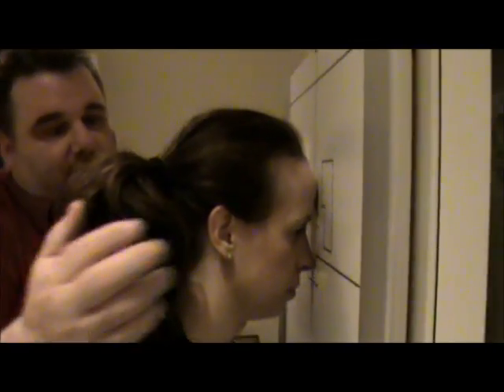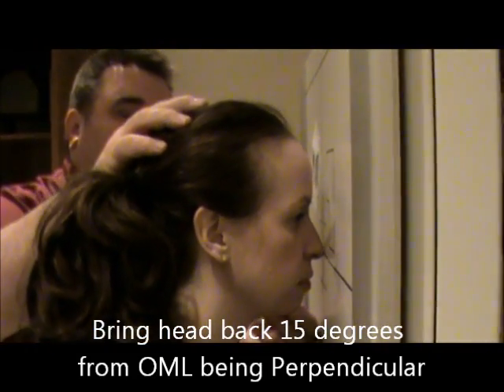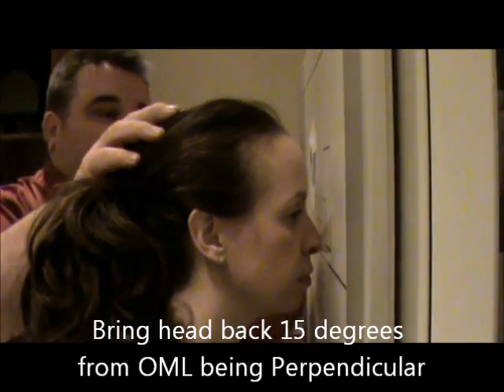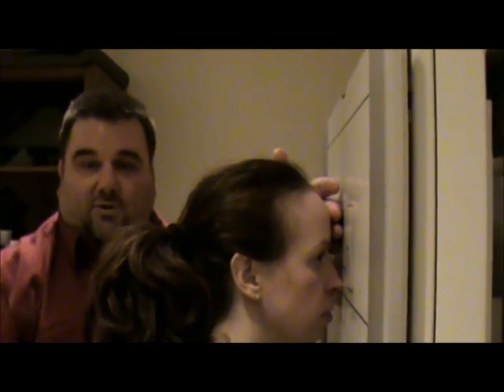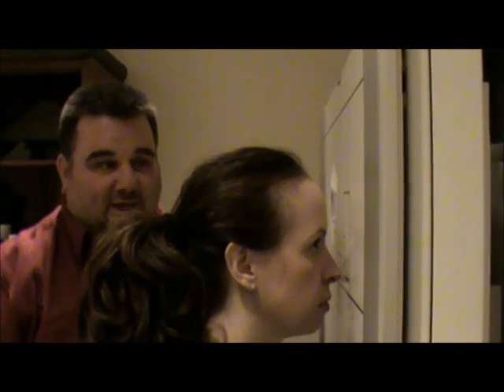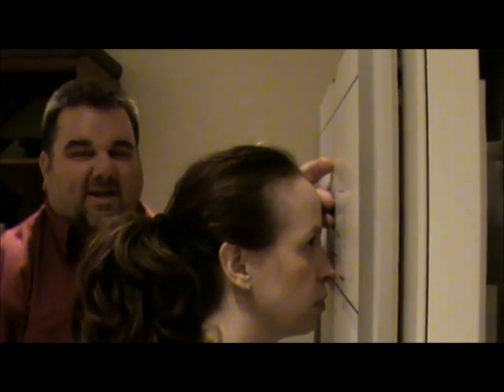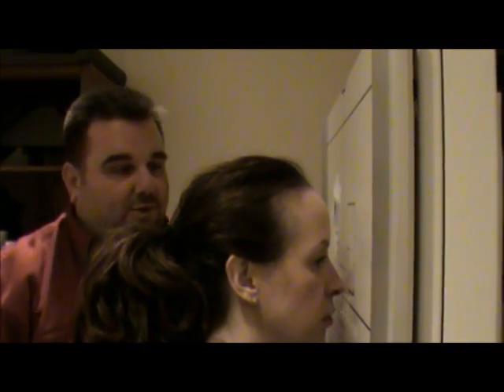We're going to get the patient up here with the forehead against the board. I'm going to position the OML perpendicular, making sure the head's straight. And then from that point, I'm going to bring the head back about 15 degrees. I usually use my fingers and just stick them between her forehead — you can use a washcloth or something like that. Bringing them back, that's about 15 degrees, and that puts the petrous ridges in the lower one-third of the orbits.